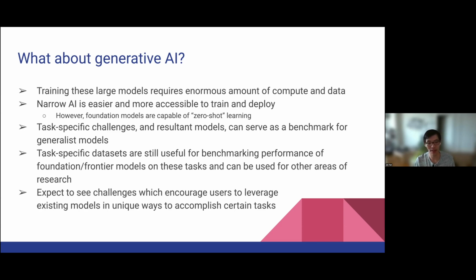But a lot of these models are still really good for a lot of tasks. And so if you're more tech savvy, maybe that's one way you want to go. But all this to say, the future challenge may be to use a foundation model to try and predict certain pathologies in certain scans or something like that. Or maybe it'll be more open-ended and some people will be using foundation models and some people will not.